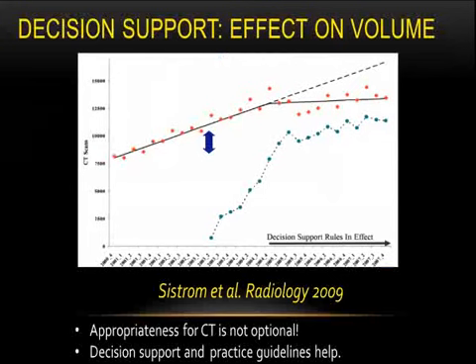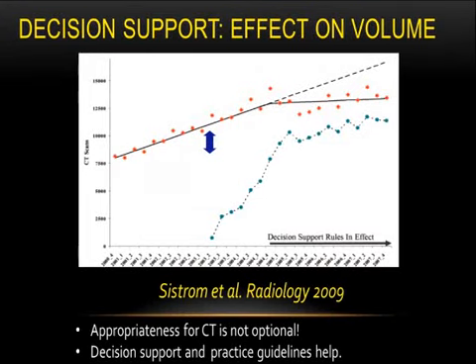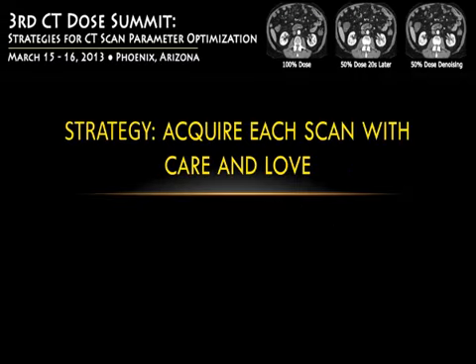Okay. And by now this has been quite popular. There's been a lot of press on one paper that came out, which showed that after the system went into effect, the trajectory of growth has actually leveled off, and it has made a difference in the overall utilization of CT. And I think this has been a great contribution to the overall population level dose reduction, if you will. Okay.